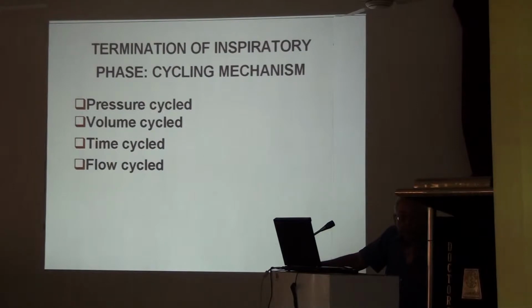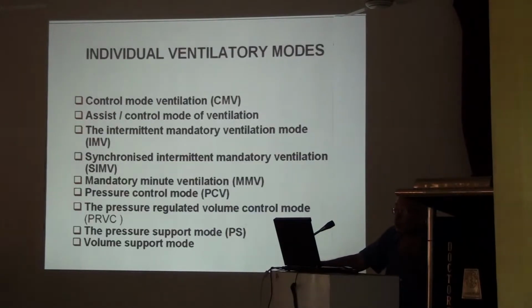But nowadays the classification is more elaborate. Actually, these are the termination of the phase, the termination of the inspiratory process of a machine. But initially it was thought that it was the beginning of the respiration. The termination: pressure cycle, which you already learned, volume cycle, time cycle, and flow cycle. When a set target is achieved, it will terminate.